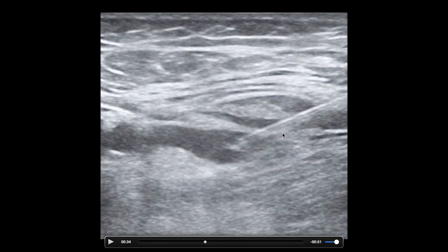The volume is going to be a little higher than you might do for other blocks — usually somewhere between 25 and maybe even 40 cc's of fluid underneath here, because you want the spread. You want to make sure to get the obturator nerve, the femoral nerve, and the lateral cutaneous nerve — that's basically all the innervation you can get. The hip capsule does have some sciatic nerve innervation, but you'll get significant if not almost total pain relief for proximal femur fractures and hip joint fractures with a fairly large volume.